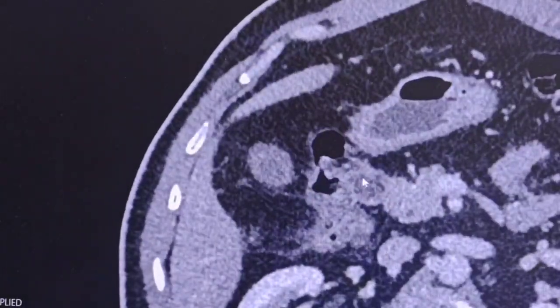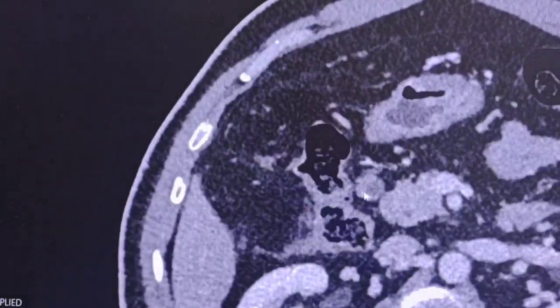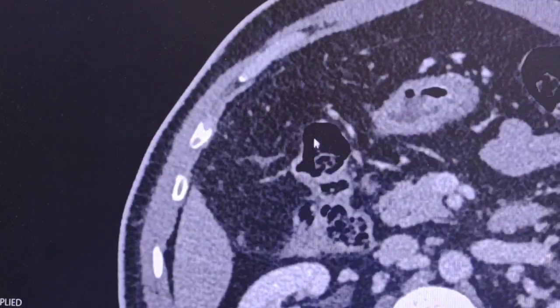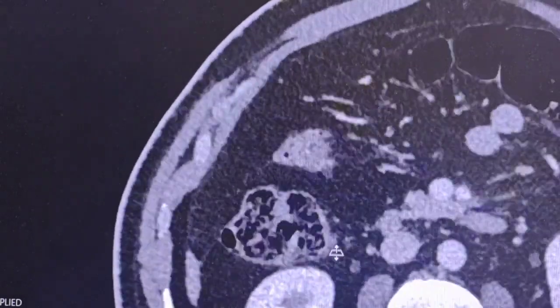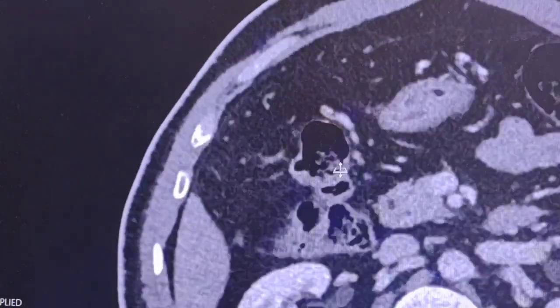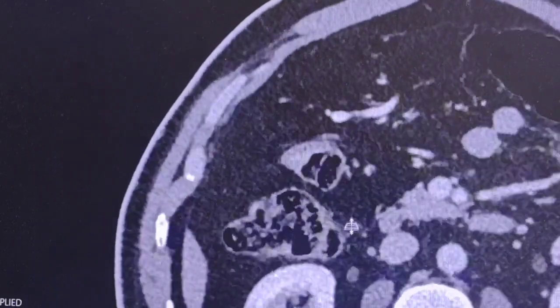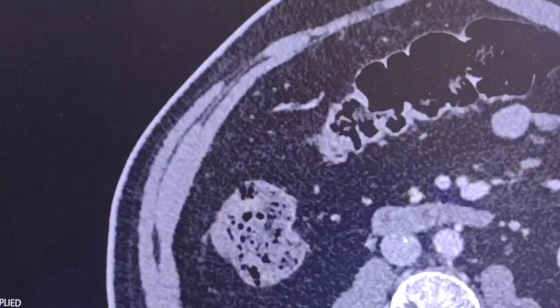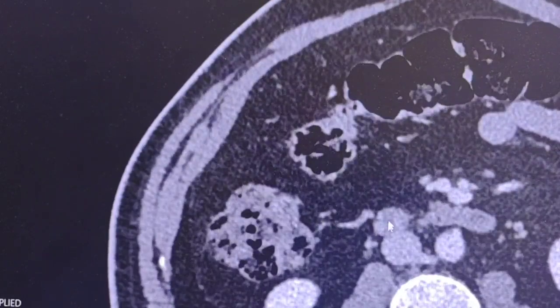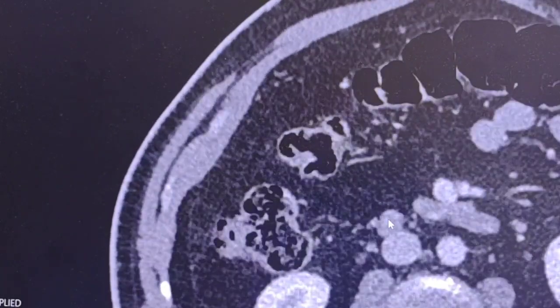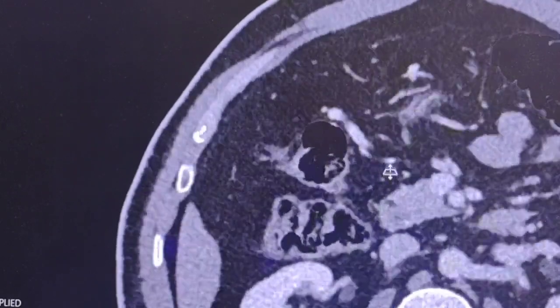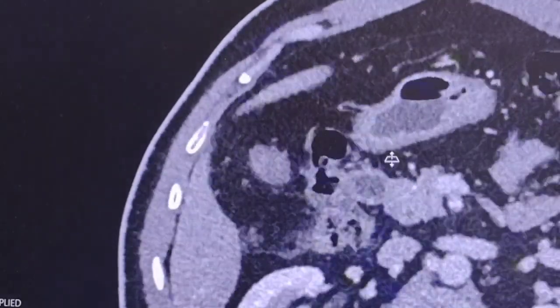The duodenum goes down, here is the pancreatic head, and the right colonic curvature. This is the duodenum — the third part of the duodenum. The second part here where my arrow is. Here it looks normal on the prior scan.